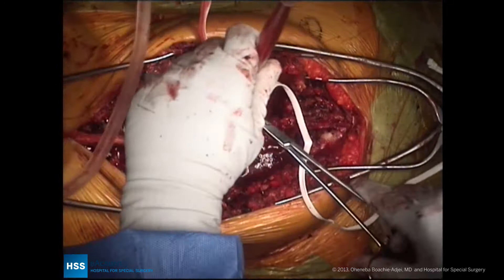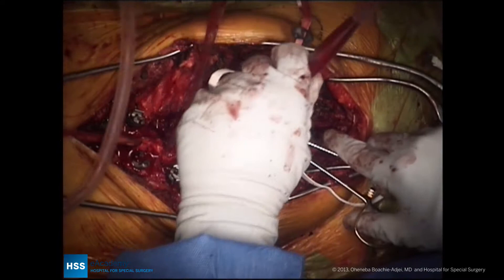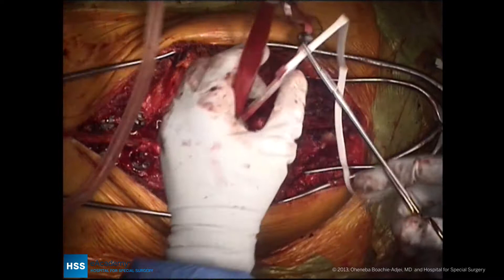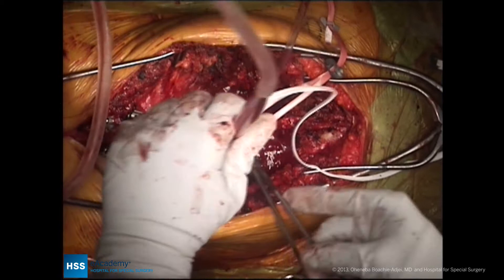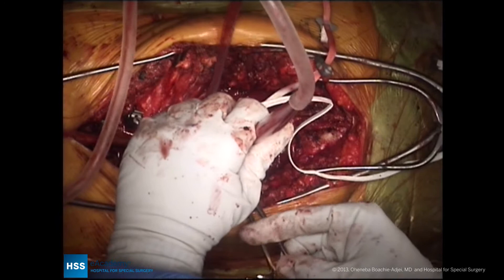Moreover, it's also very important to pay attention to the fractional lumbosacral curve. By correcting the fractional lumbosacral curve, that also allows us to shift her from left to right to improve her coronal shift. It's very easy to fall into a trap of trying to correct the lumbar curve, which is more flexible than the lumbosacral fractional curve, and then ending up with a worsening of the coronal plane deformity.